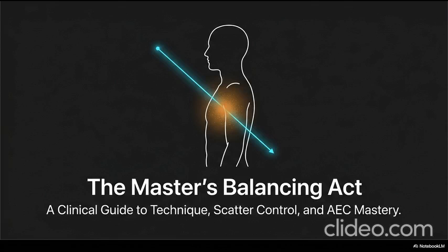Okay, here is where it gets really interesting. Okay, lay it on me. In the old days of physical film radiography, if you made a mistake with your AEC, say you accidentally left the beam on way too long because of a titanium hip, the physical piece of film would come out of the processor pitch black. Right, the error was undeniable. But today, almost all radiography is digital. What happens when you wildly overexpose a patient on a modern digital system?